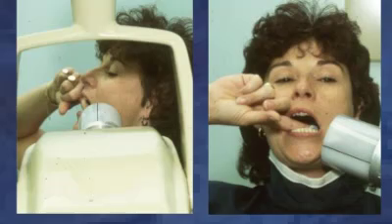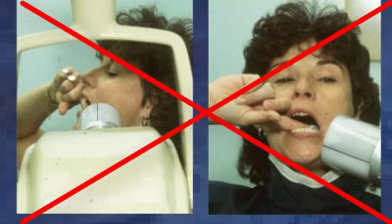It is important to keep in mind when taking these radiographs on a patient to never let the patient use their fingers to hold the receptor.